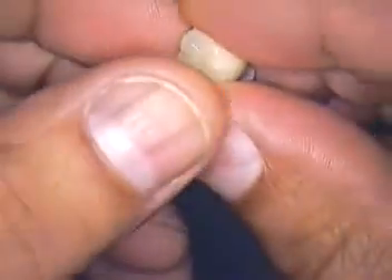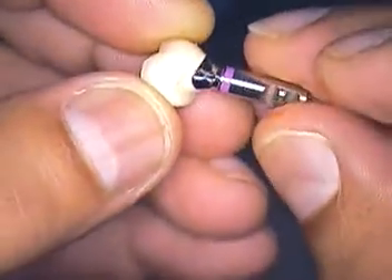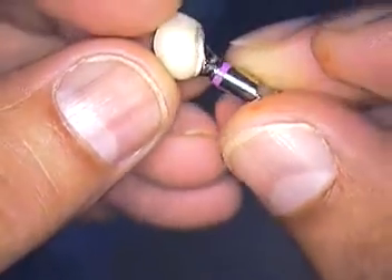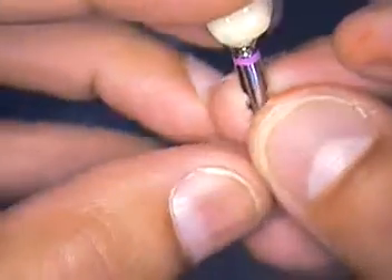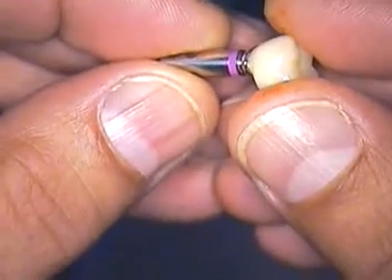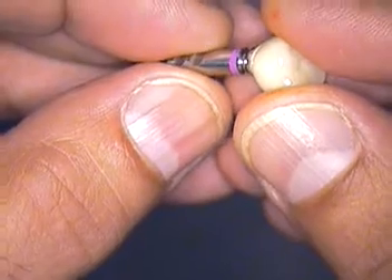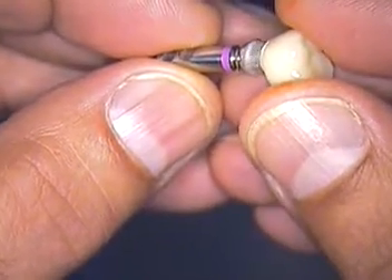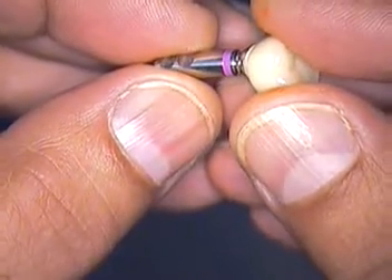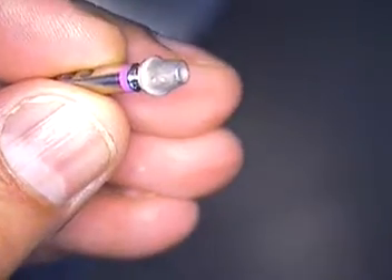Hello everyone and welcome back. This is Dr. Jerry Cuomo. I just want to recap about this particular case. We started with a Straumann bone level implant where the periodontist placed the implants a little off — they weren't really dead on in the tooth position — so we had like one and a quarter teeth in the interproximal.